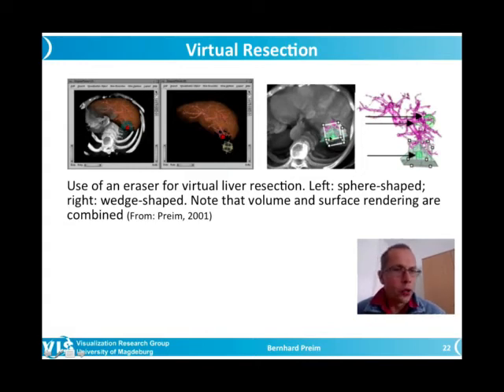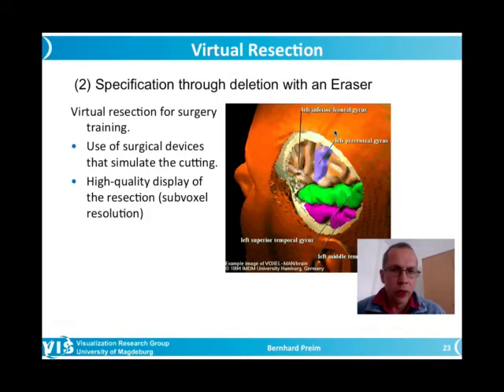So there were also different resection types. Here a wedge type resection could be defined. Of course this is not restricted to a sphere. So that was not bad, but it was not the end of the story. It was not so successful that we really made it part of the system that the surgeons regularly used. I just want to mention that similar techniques have been used by others as well. Partially, I became aware of this even later.